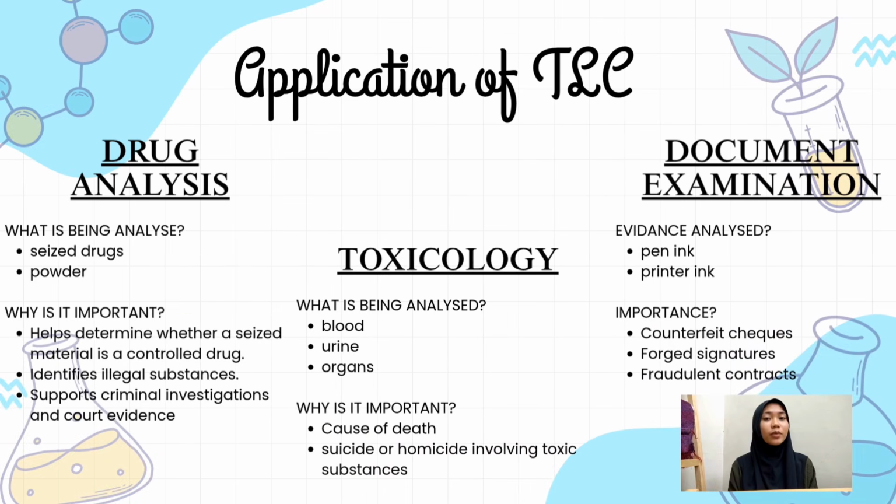Now, I will explain some important applications of thin layer chromatography, or TLC, in forensic analysis. The first application is drug analysis. TLC is widely used to identify illegal drugs such as cocaine, heroin, methamphetamine, and so on.